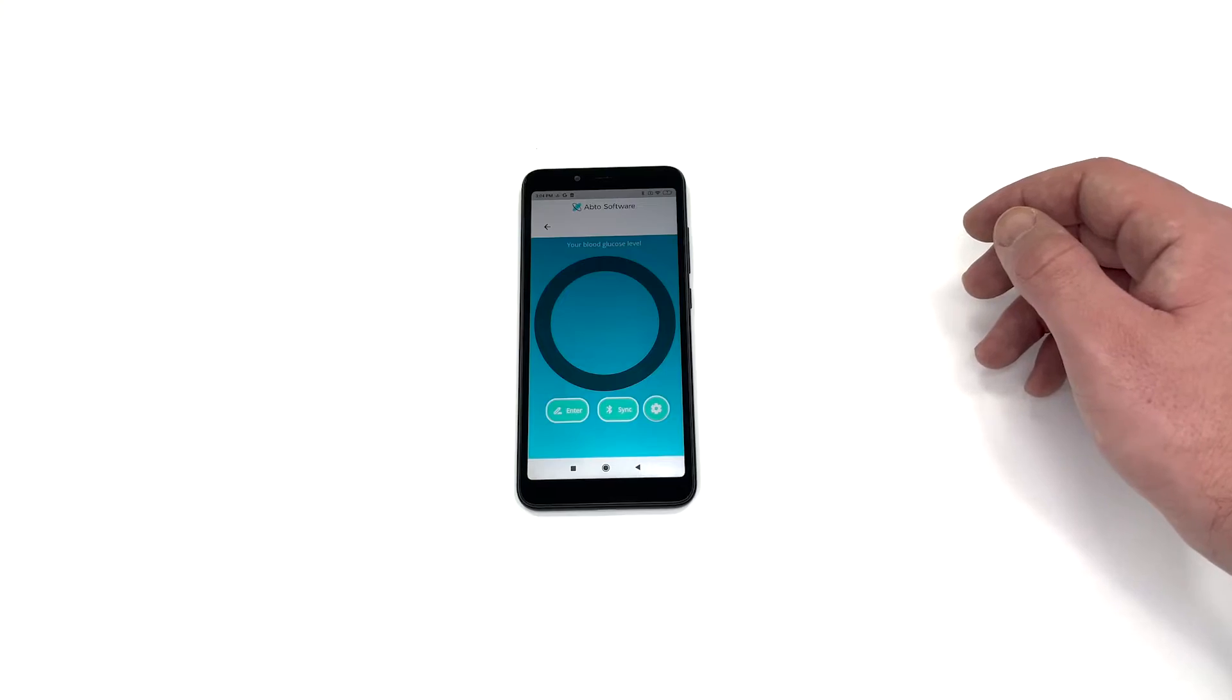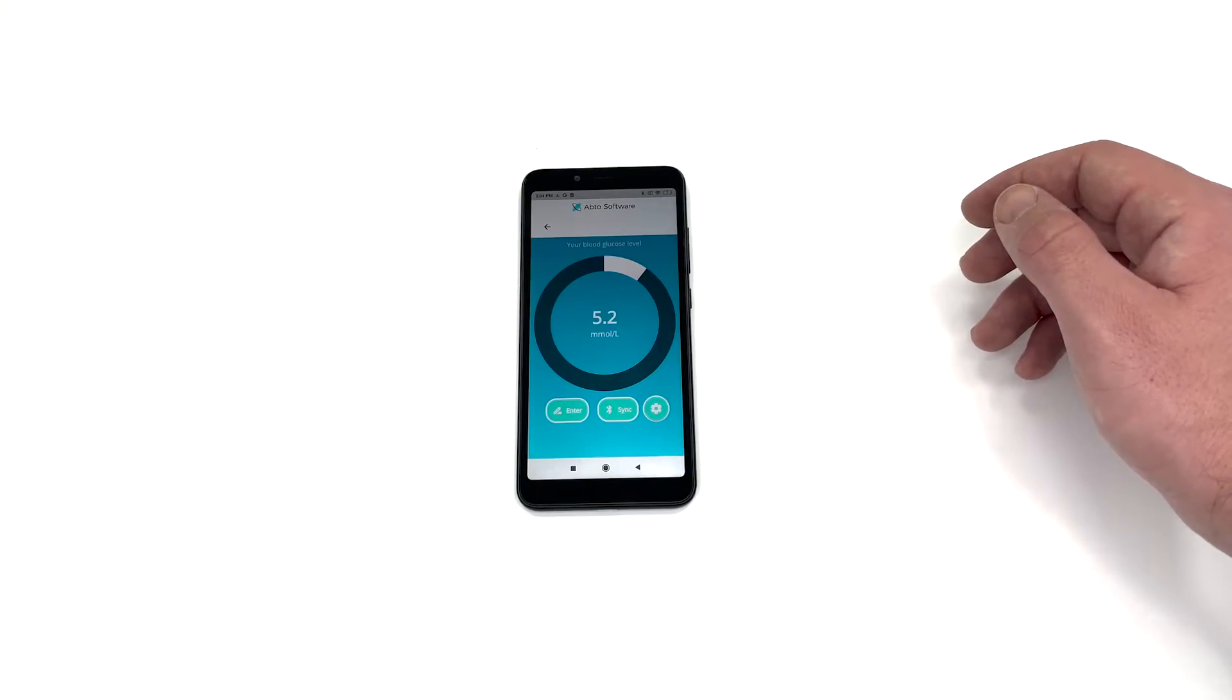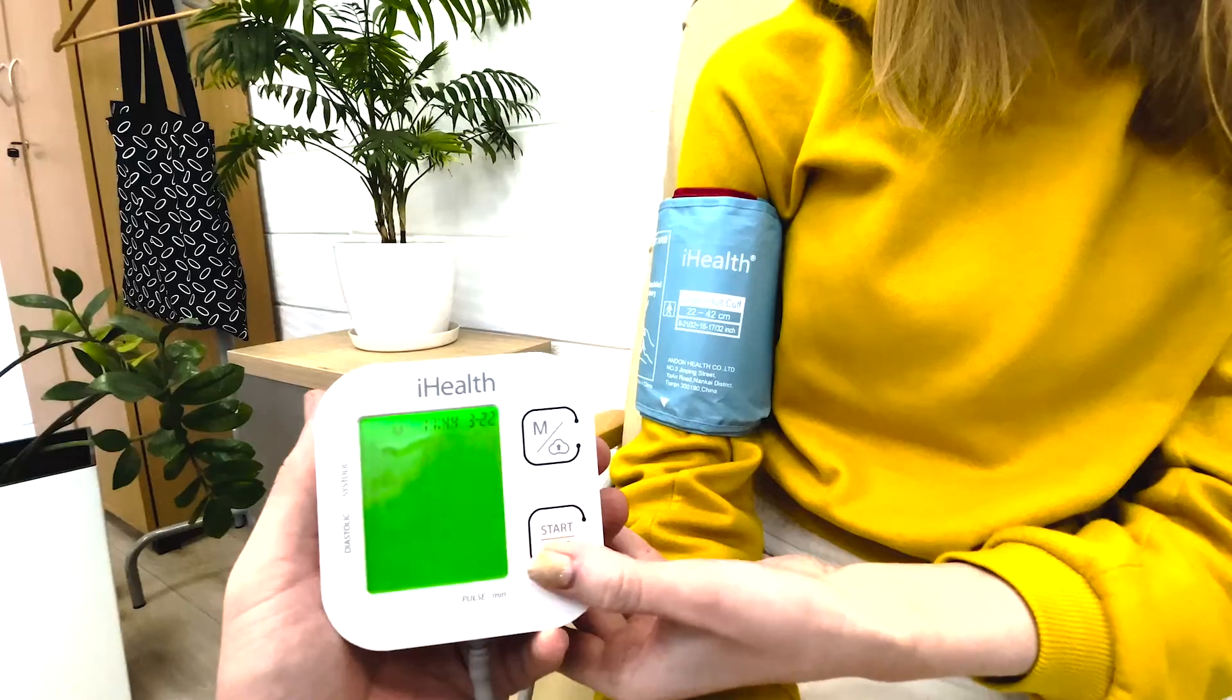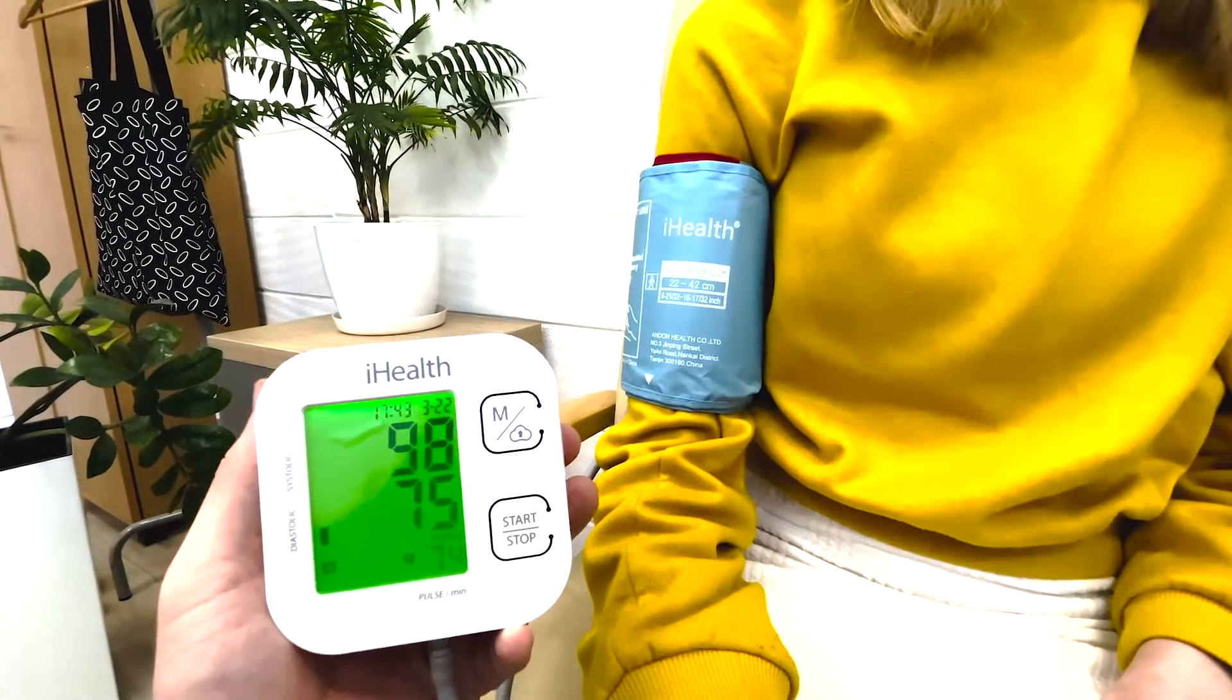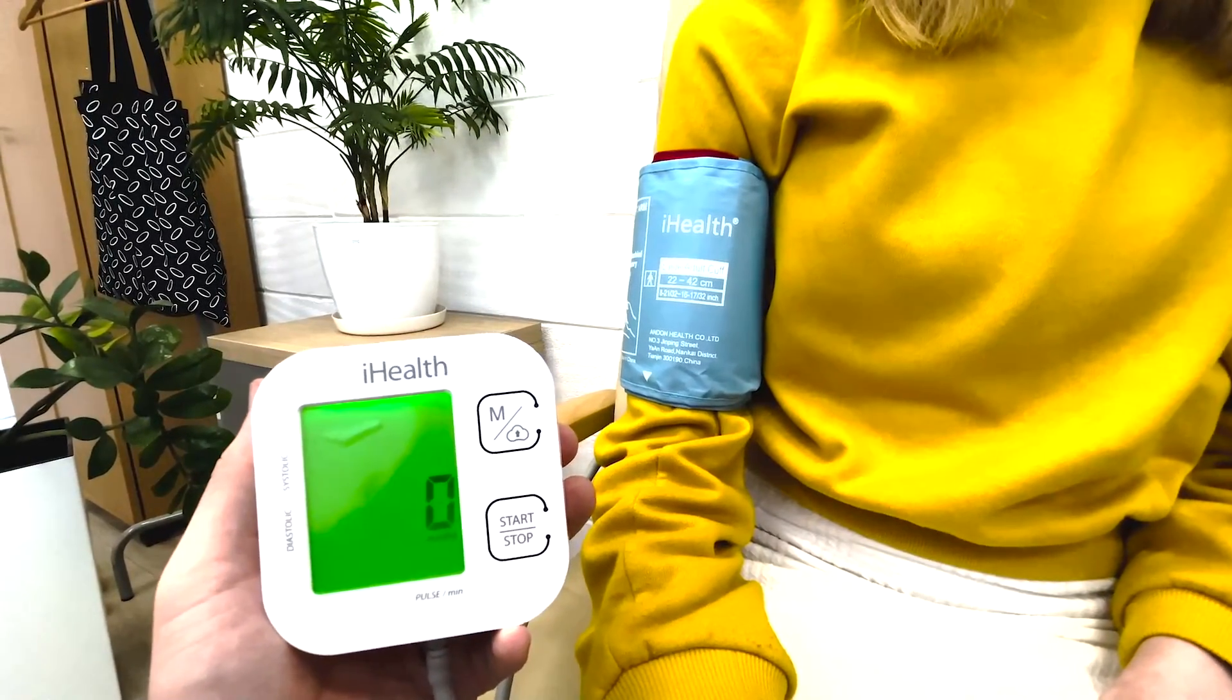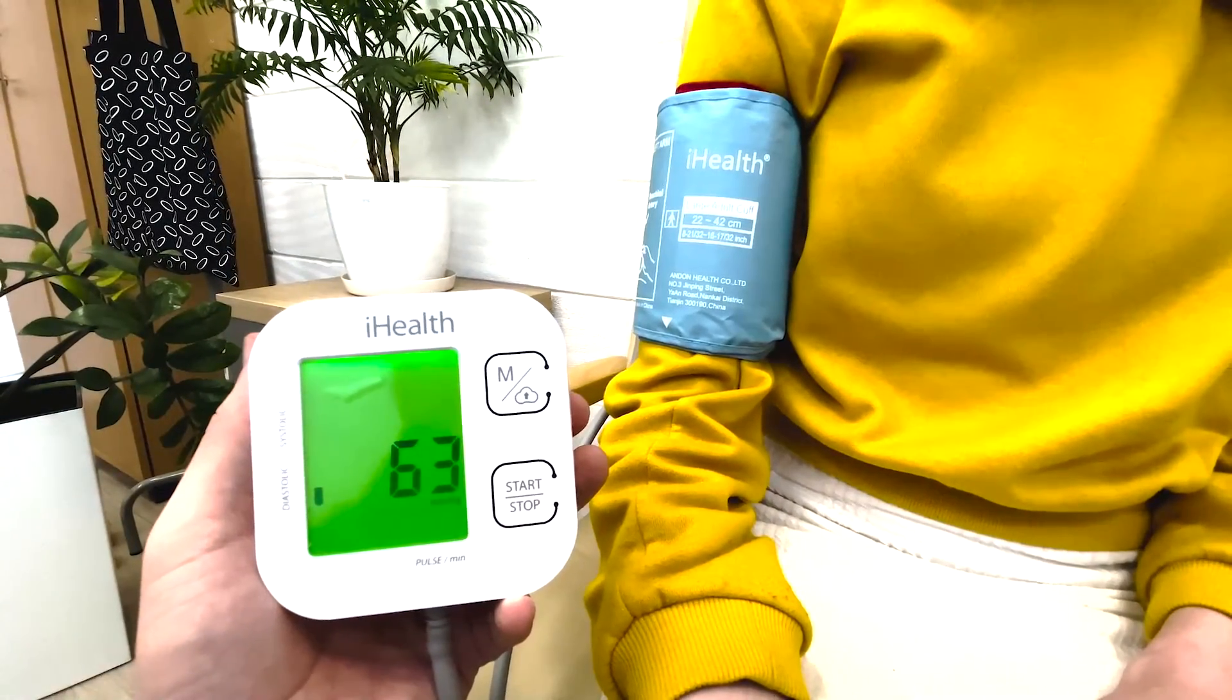Another personal medical device that can be connected via Bluetooth is a personal blood pressure monitor. The process of connection and synchronization is exactly the same.